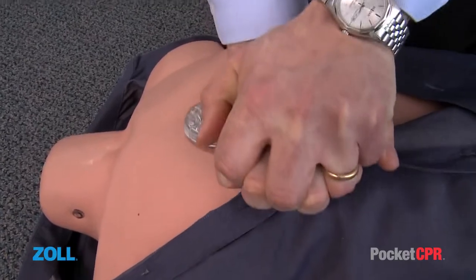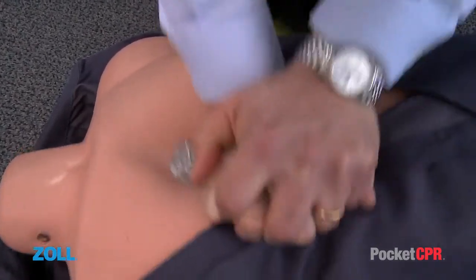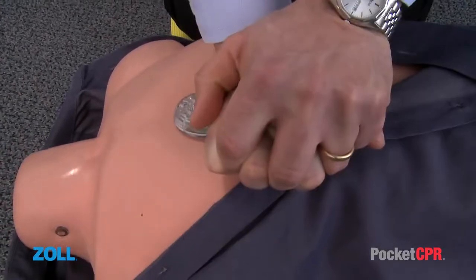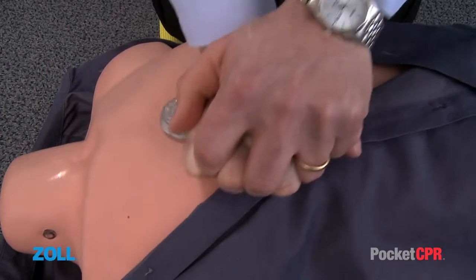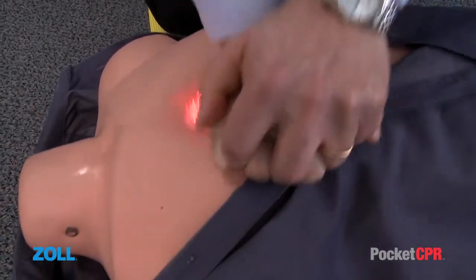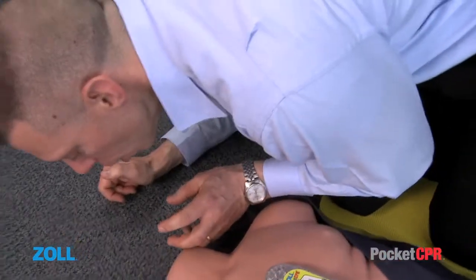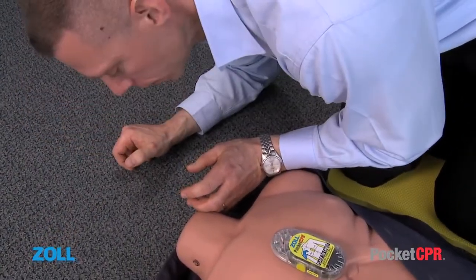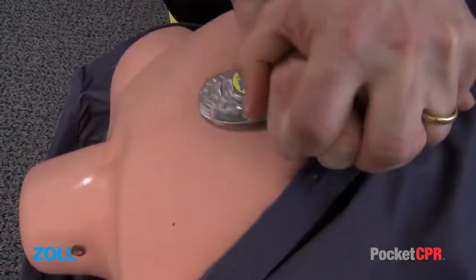Push hard and fast, counting to 30 compressions. A single LED will flash 100 times per minute. All 4 LEDs will flash to let you know your compressions are at the right depth. When you pause compressions for ventilations, the unit will continue to flash 100 times per minute. 4 lights will flash when your depth is again sufficient.